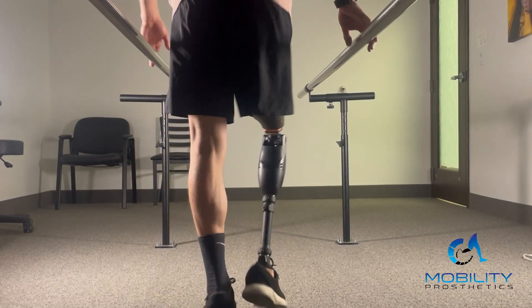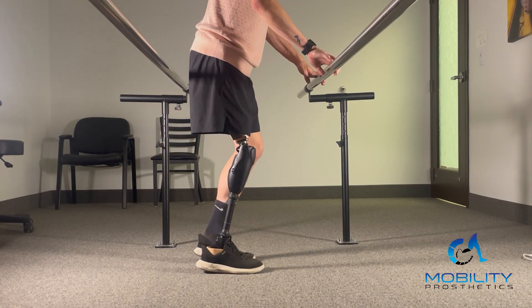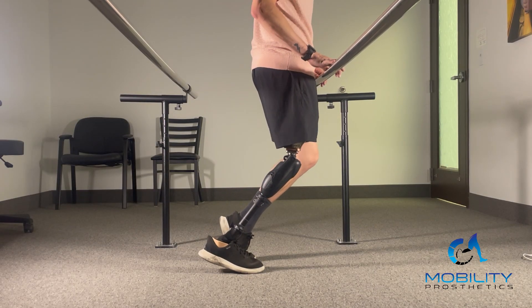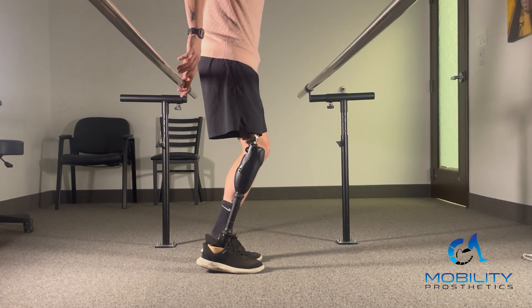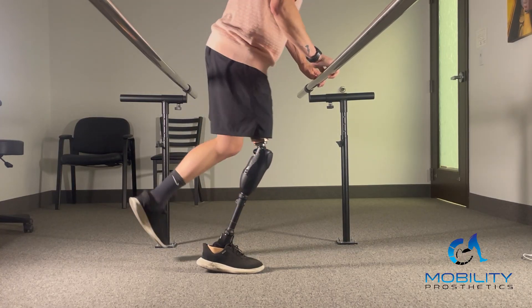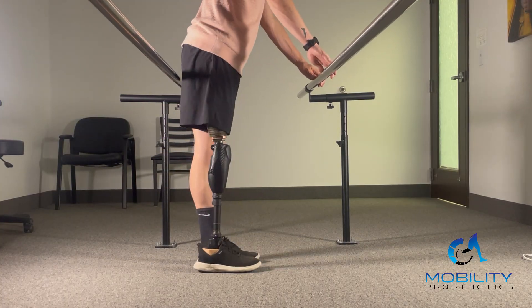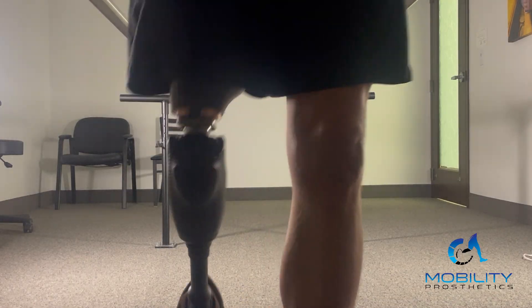Here I'm going to be using the stance lock. You wait it for three seconds and it's locked. What's different about Quattro is that you can shift your weight all around, shift up onto your tippy toes, really move around on it, and it is not going to release and go into swing mode or walk mode. It only releases once you pull weight off of it — once weight is fully released, it releases.